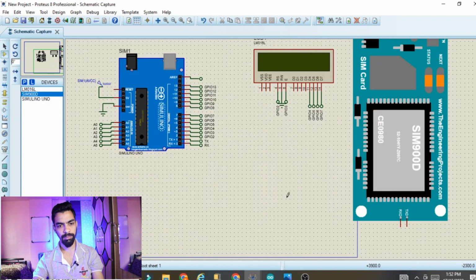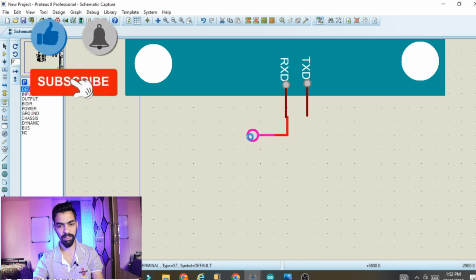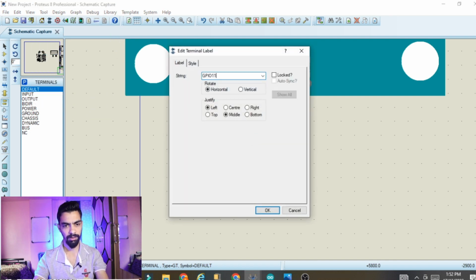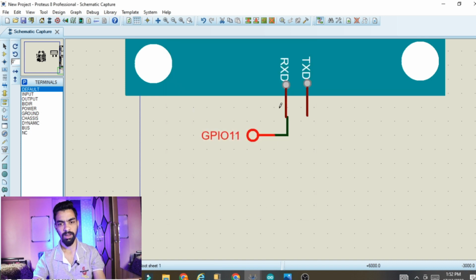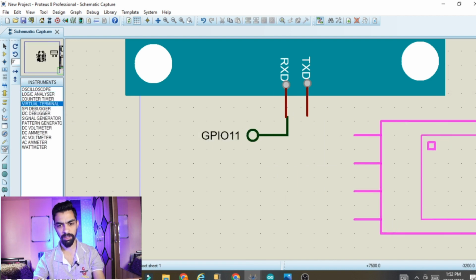This RX pin of the GSM, you can see this is the RxD pin of the GSM. So the RxD pin should be connected to GPIO 11. So we require one default pin. Go to default terminal mode, click on default, place one default pin here and connect that default pin here and double click here, give your name GPIO 11 and click on OK. Then this TXD pin should be connected to the serial terminal. Where you find the serial terminal, here you can see this one, serial, inside this, and here you can see virtual terminal, and place that virtual terminal here.